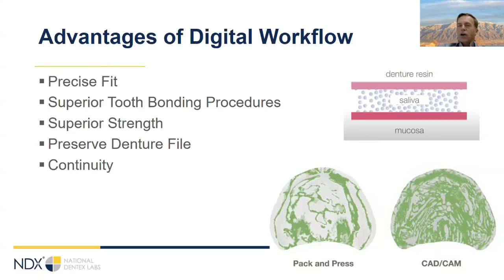When the teeth are attached to the pink base, they're bonded in a similar way to how you do a direct composite restoration of the mouth. So there's no wax to get in there. They're bonded during the curing process. Essentially, they become one piece. They can't come apart.